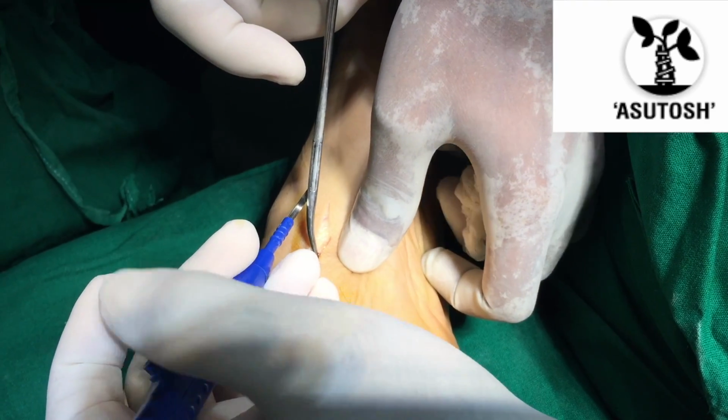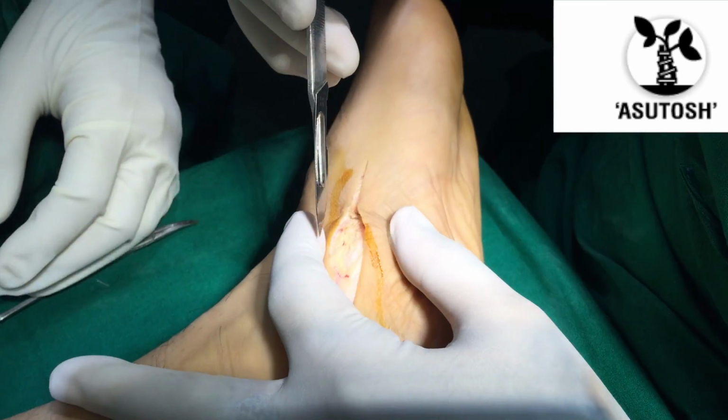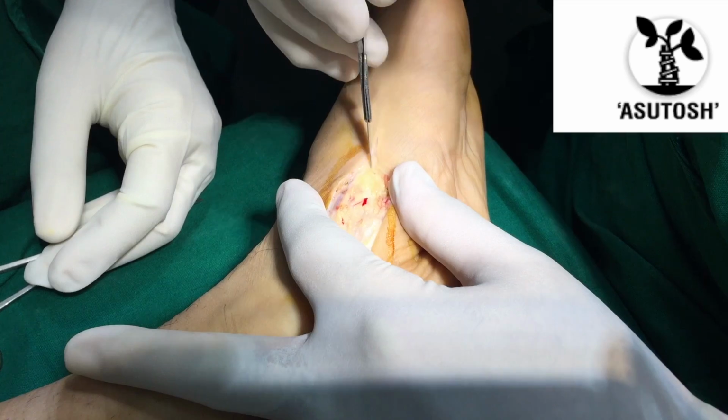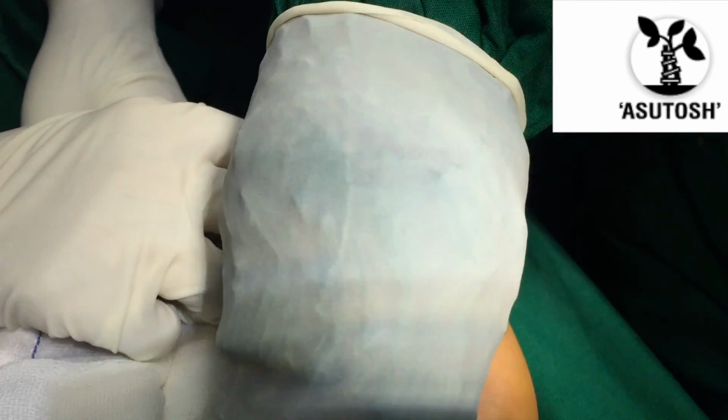So we are now coagulating these vessels, and further, in a paintbrush-like manner, we are extending our incision into the posterior tibial tendon sheath.